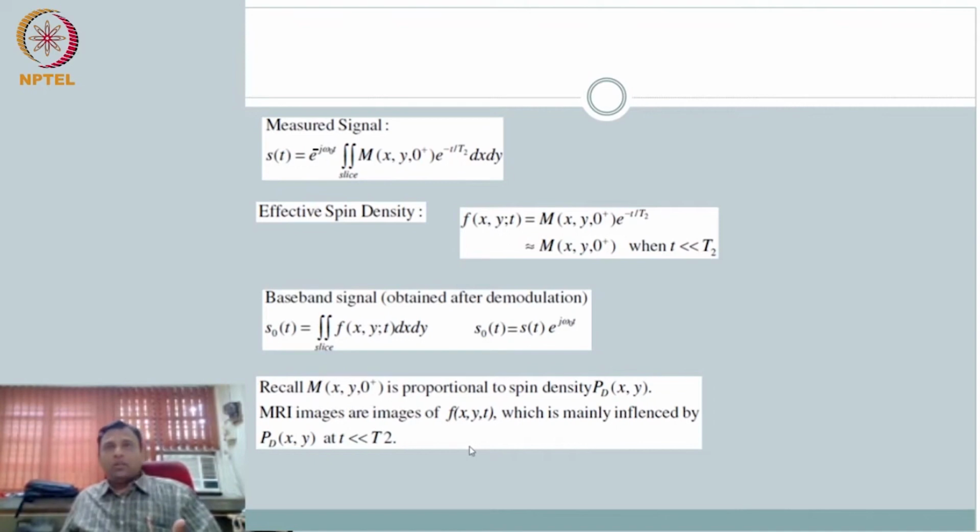So naturally you want good signal. Therefore you're not going to have an ideally thin, infinitesimally small imaging plane. It's a trade-off, and that is already one trade-off in the slice thickness direction. The story doesn't end here. We will have some slice thickness that gives us the best signal possible, or a signal level that is acceptable to us, and the resolution is acceptable to us.